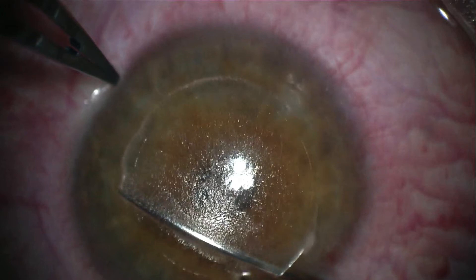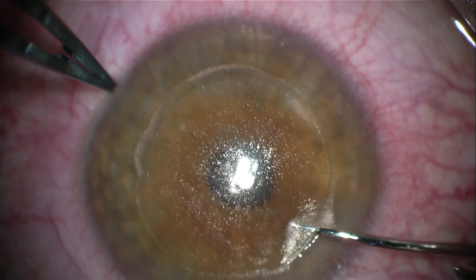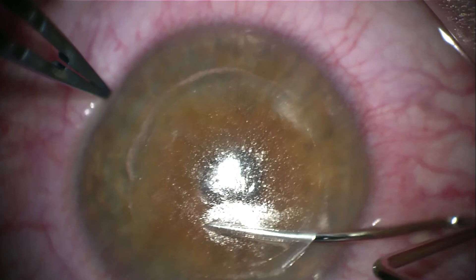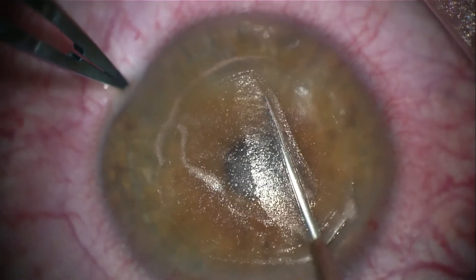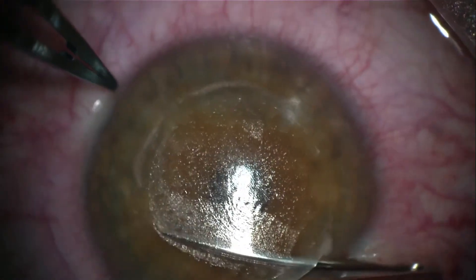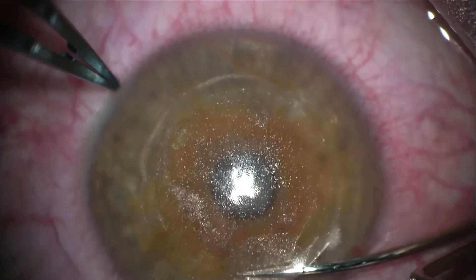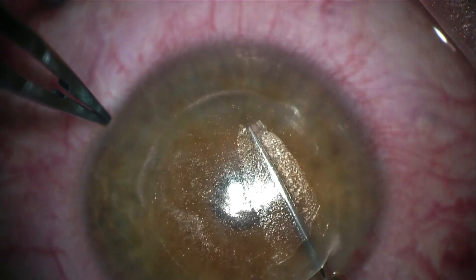After this dissection, the spatula needs to be entered in the inferior pocket, bringing the spatula under the lenticule. Again I will first go all the way to the other side of the lenticule, followed by a dissection to the right. However, now I will leave a small triangle undissected, which will keep the lenticule in place when dissecting the left-hand side. Then I go to the left of the lenticule — it is the small triangle left in place that prevents the lenticule from sliding. After the dissection on the left is completed, all I need to do is go under the small triangle and the lenticule is completely free.